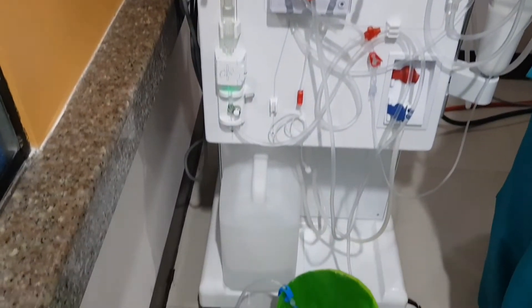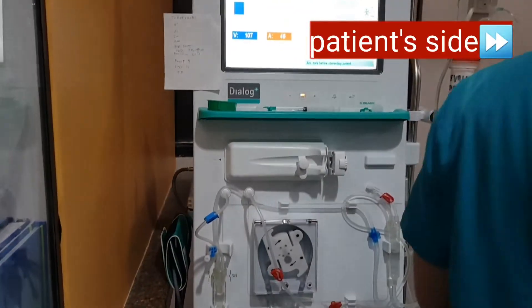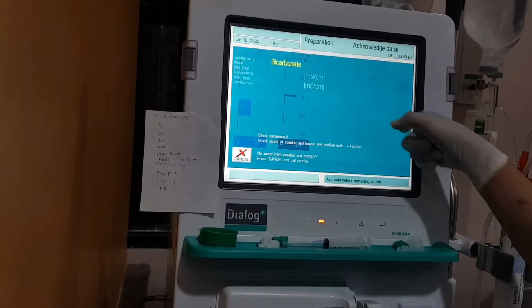Here is the setup. Connect the arterial line to the arterial port of the catheter. Open the big red clamp and the arterial port clamp.